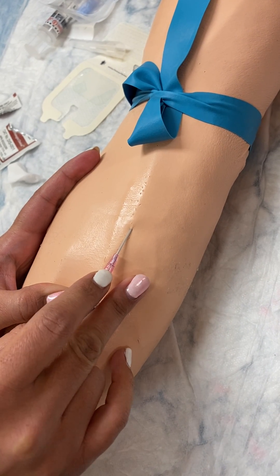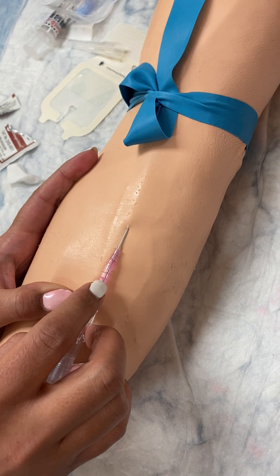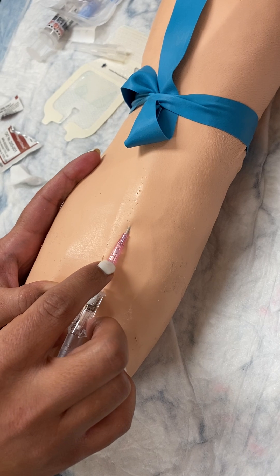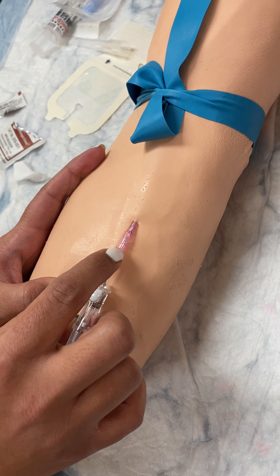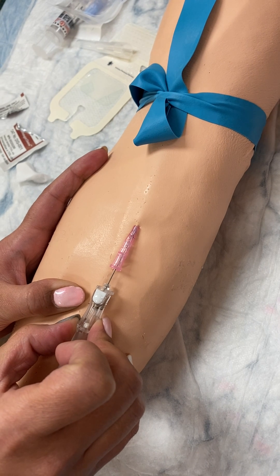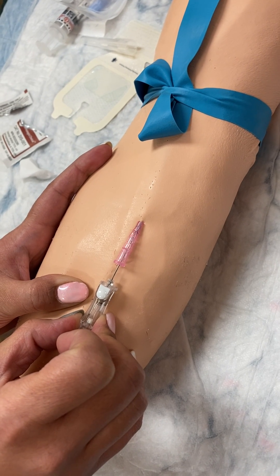She's inserted the needle and she's looking for flashback in the chamber. She'll advance until she gets flashback. Now she's got flashback, and you can see that she hasn't inserted the needle any further — maybe just a little bit after she got flashback, about 0.5.